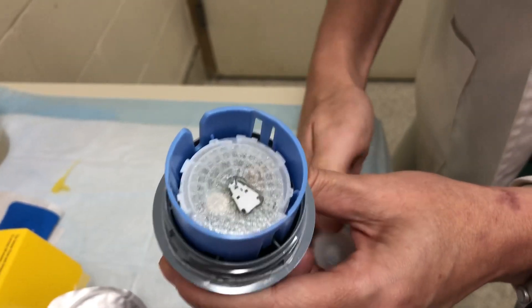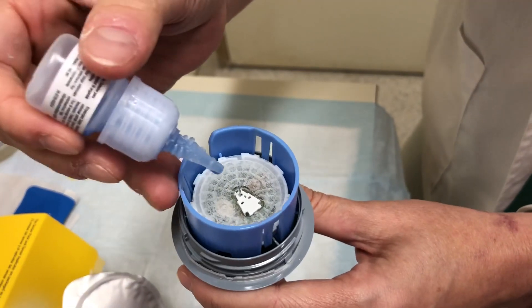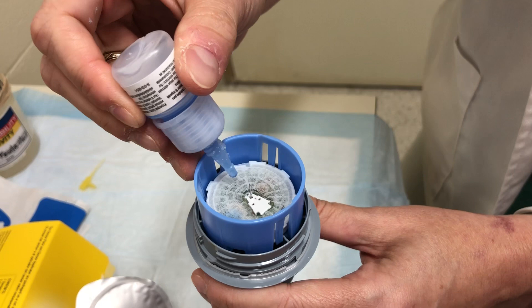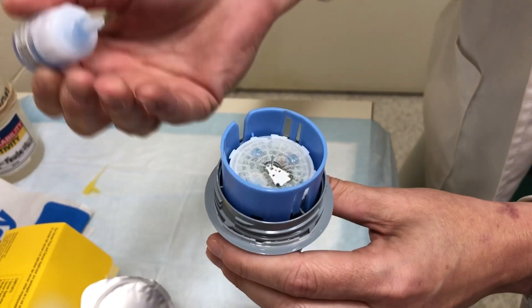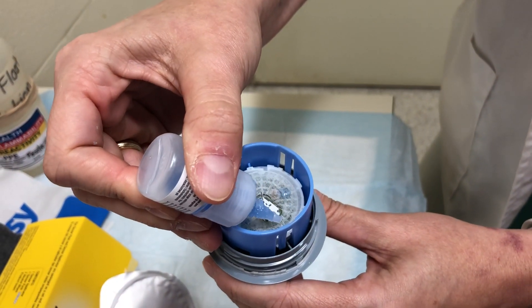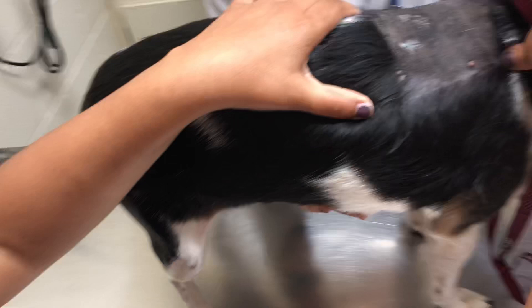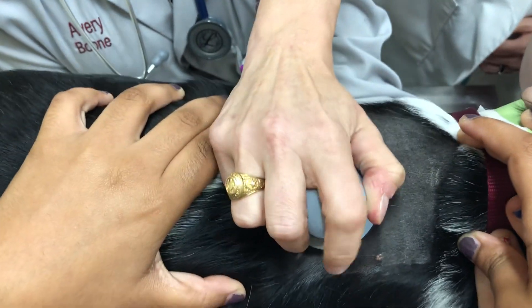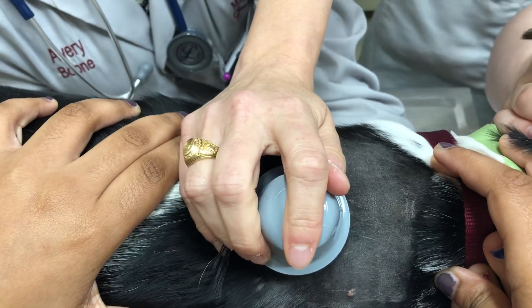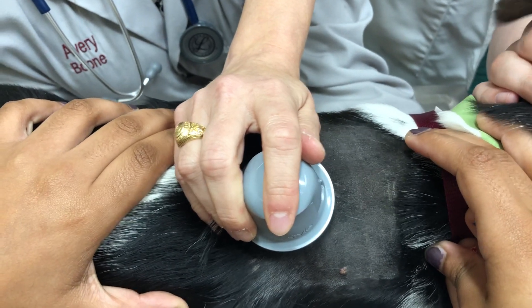Now I'm going to put some tissue glue — not superglue — at a few sites just so it stays on, because dogs like to move around. Just one more, not too much because it'll seep out the side as I discovered last time. Now we're going to go over to the site right there, push down, and hold it there for 30 seconds.